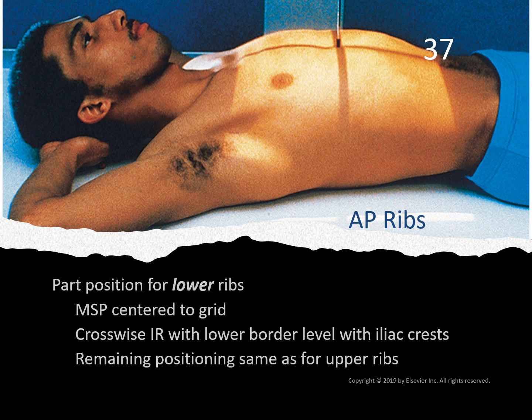Okay. Low kV, low energy is going to ensure that we get a lot of absorption of the X-ray by the rib bones themselves. Whereas 120 kV will overpenetrate the ribs, and the ribs won't absorb many of the X-rays at all. Okay. So we're changing the subject contrast by changing the technique. We're making it so it's easier to visualize ribs rather than lung tissue.